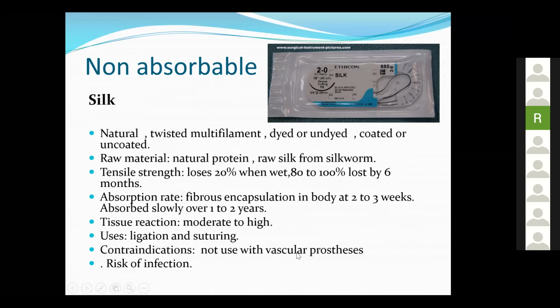And wherever there is severe tissue reaction, there will always be a risk of infection. So do not use it wherever we are using implants, meshes, or other suture material, the vascular suture material.